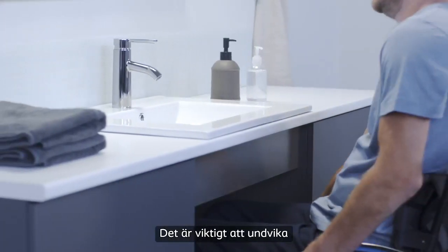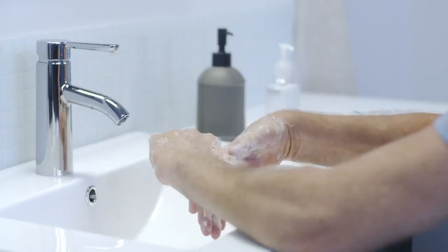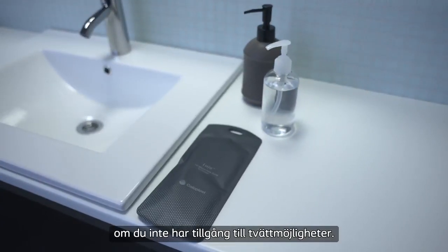It's important to avoid transferring bacteria from your hands to the catheter, so start by washing your hands thoroughly with water and soap, your thumbs too. You can use alcohol hand gel if you don't have access to washing facilities.